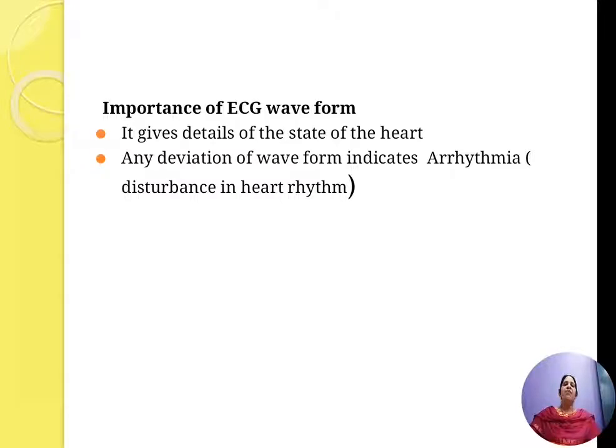Any deviation of the waveform from its normal indicates arrhythmias, that is, disturbances in the heart rhythm. This is about the importance of the ECG waveform.